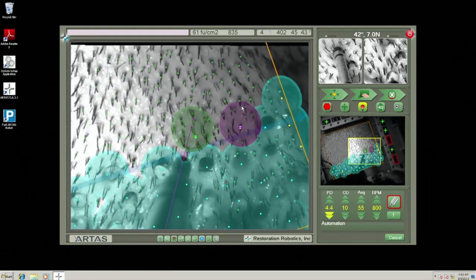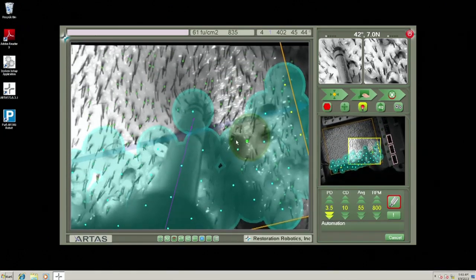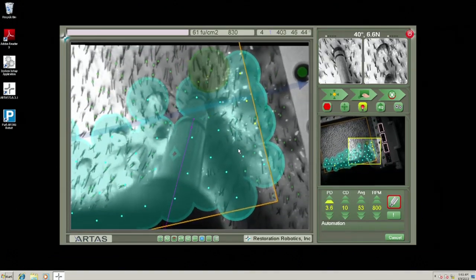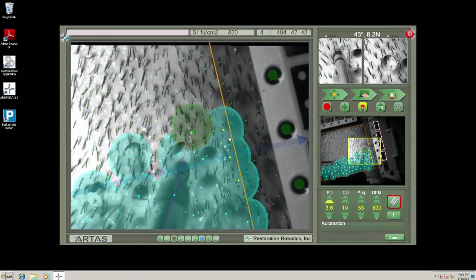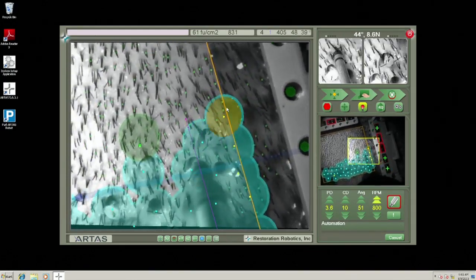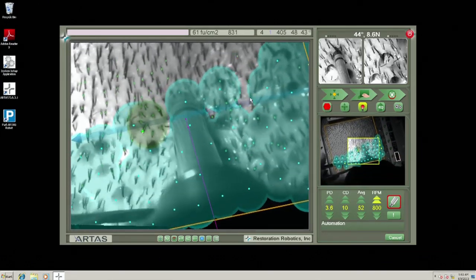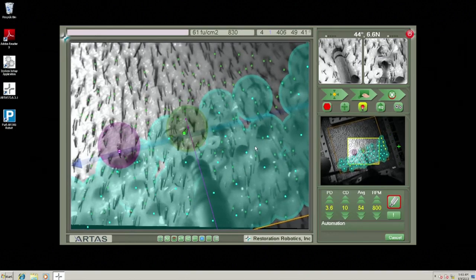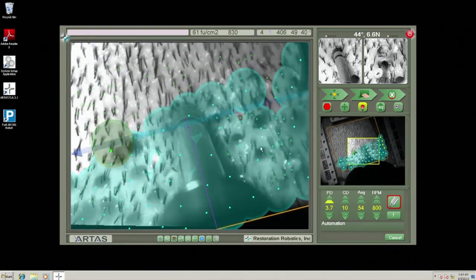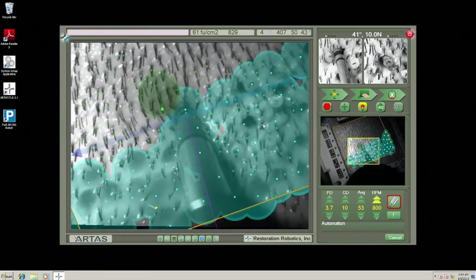just being able to. The sooner that you get to the bigger cases, the 2,000, the 3,000, even 4,000 we've done, when you do these bigger cases, you'll figure out the limitations and the learning curve. You'll progress through your learning curve much faster. If you continue to do 400 or 500 graft cases, little hairline things or maybe some crown work, then you're going to be limited in how quickly you can get through your learning curve.